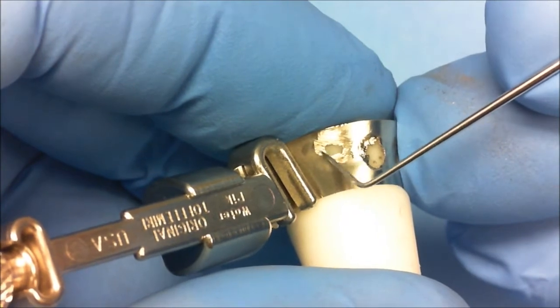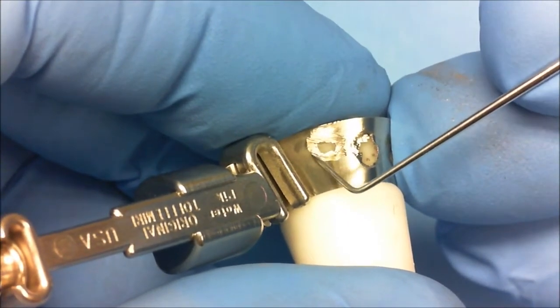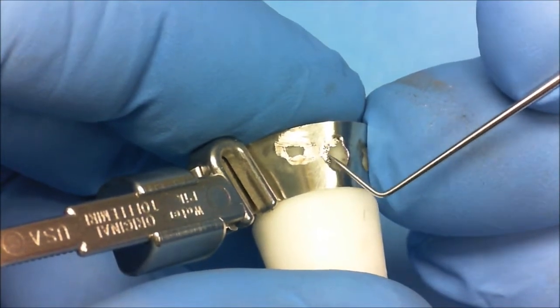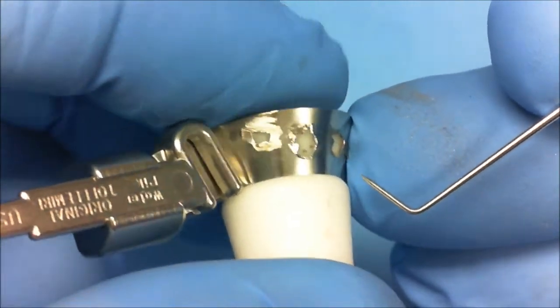On close examination, you will notice that the transition from the periphery of the opening onto the tooth is imperceptible to the explorer tip.